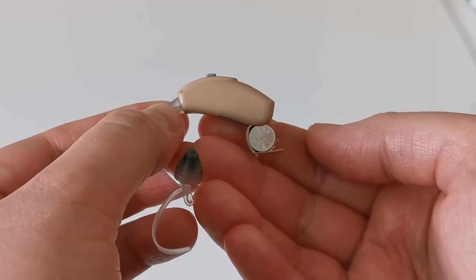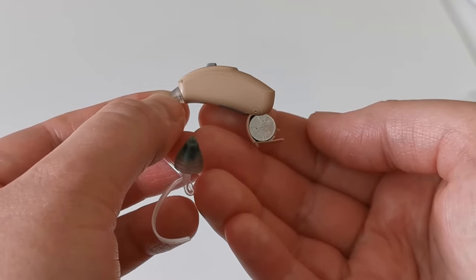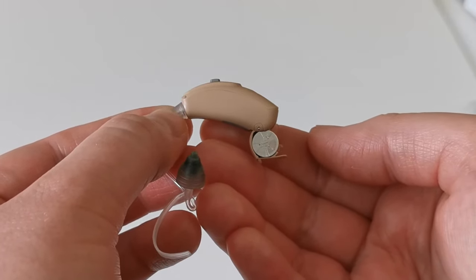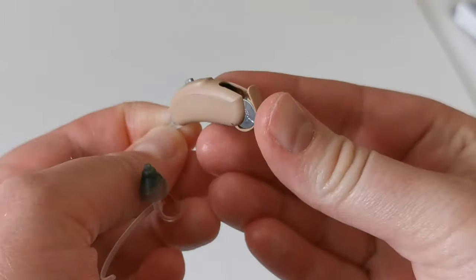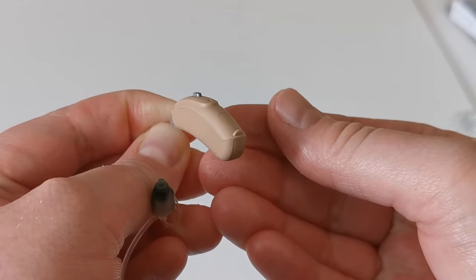In this video we will show you how to turn the hearing aid on and off. To turn the hearing aid on, make sure that there is a working battery in the battery drawer. Simply close the battery drawer and you will feel a click once it is in place.